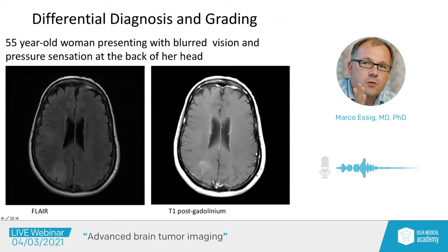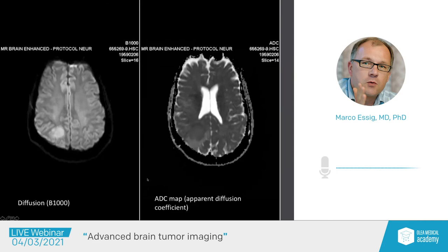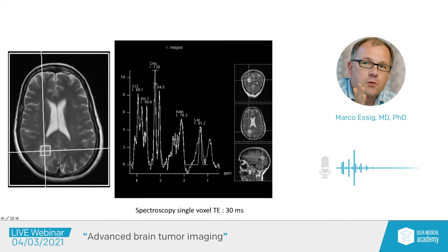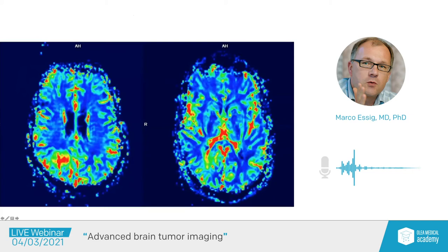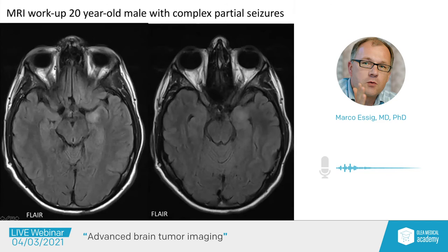A 55-year-old woman presented with blurred vision and pressure sensation at the back of her head. FLAIR shows tumor tissue with some gadolinium enhancement and central enhancement with larger FLAIR changes. Diffusion imaging shows a little restricted diffusion suspicious for high cellular density. Spectroscopy shows high choline, low NAA, and presence of lactate — a clear indicator of likely high-grade tumor. Adding perfusion shows high blood volume, very classical for a high-grade tumor, and the patient was diagnosed with glioblastoma — not strongly enhancing, but classical on histology.